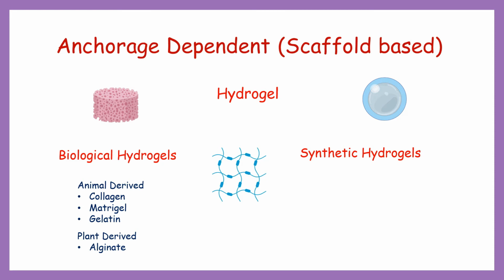Another natural hydrogel is alginate, that is isolated from the cell walls of brown algae. The mechanical properties and rapid degradation of the alginate hydrogel somewhat limit its application for 3D cultures, but alginate hydrogels have found their use as 3D printed scaffolds for specialized tissues such as vascular tissue, bone, and cartilage.